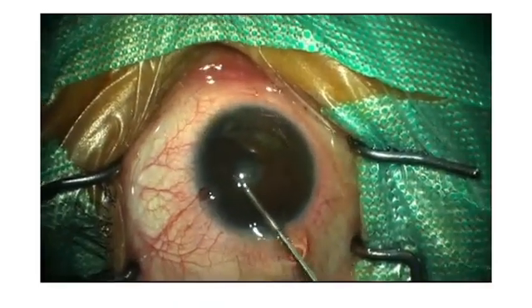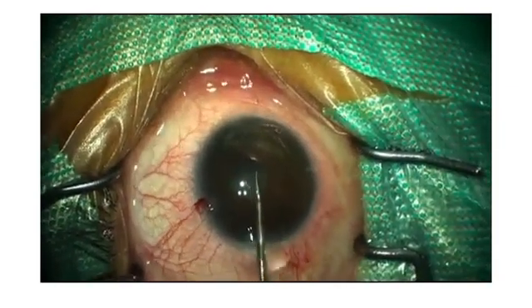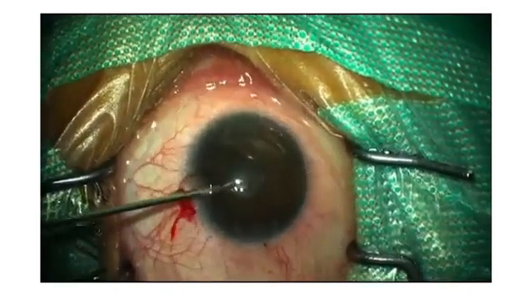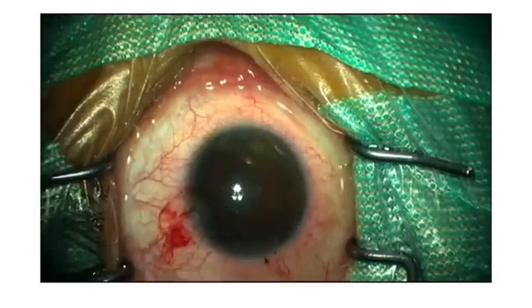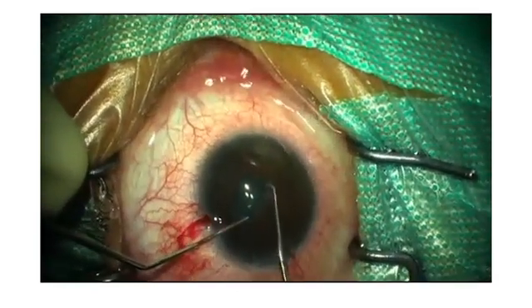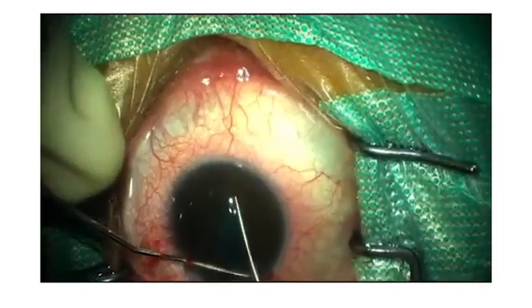Another way is we can use this intraocular scissor to cut the iris sphincter and use the instruments to dilate the pupil again with 90 degrees apart. We rarely use this technique now because it is going to cause bleeding and it is going to cause more trauma to the pupil.